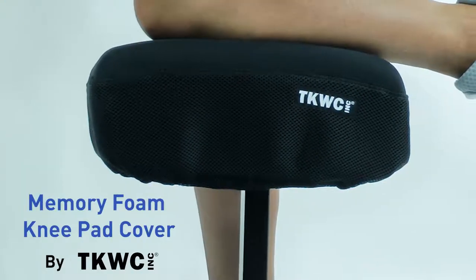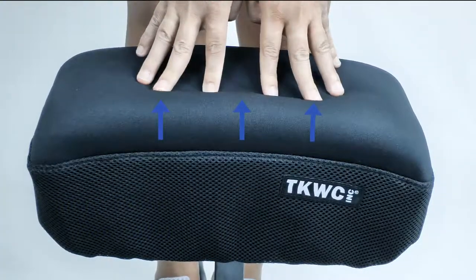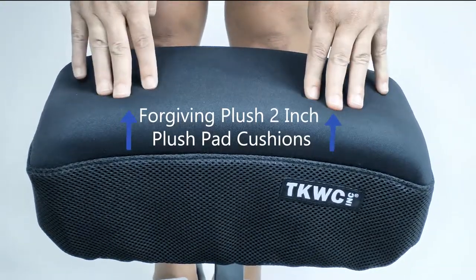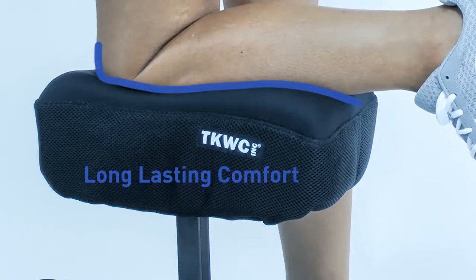The Memory Foam Knee Pad Cover by TKWC Inc. provides a happier and more comfortable recovery during all-day use. The forgiving two-inch plush pad cushion reduces pain and fatigue in the hip, knee, and leg. The Memory Foam provides long-lasting comfort and cushion while distributing pressure evenly across the knee pad platform.